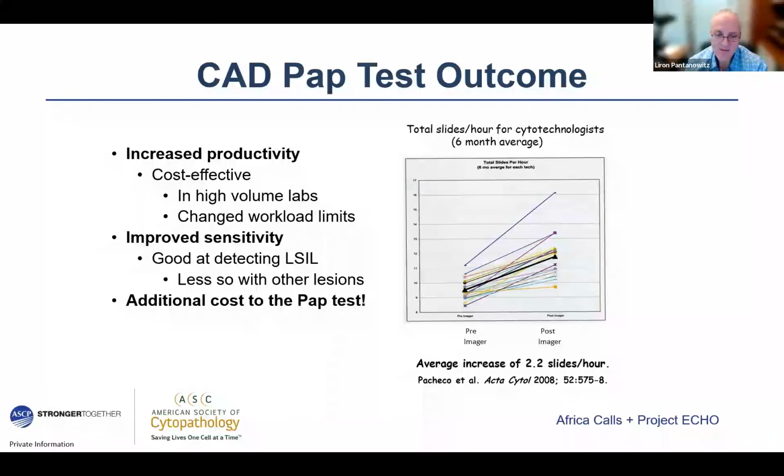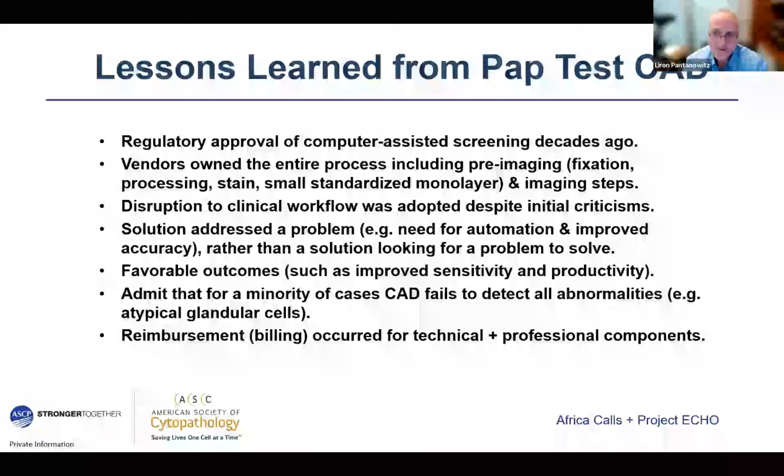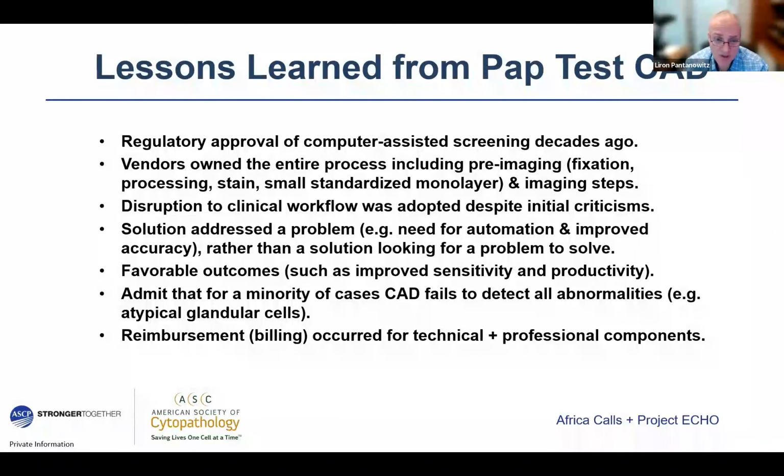But it is true that if you bring in new technology, you have to pay for it. And so every additional advancement in the screening of Pap test will drive the cost of the Pap test up. So what we learned is that people are afraid of bringing on AI today because regulatory bodies, like in the US, the FDA, or in Europe, CE mark approval, they may not give us approval to use AI, but that's not true. If you look at decades ago from Pap tests, yeah, all these regulatory bodies approved using computers to help us screen Pap tests.